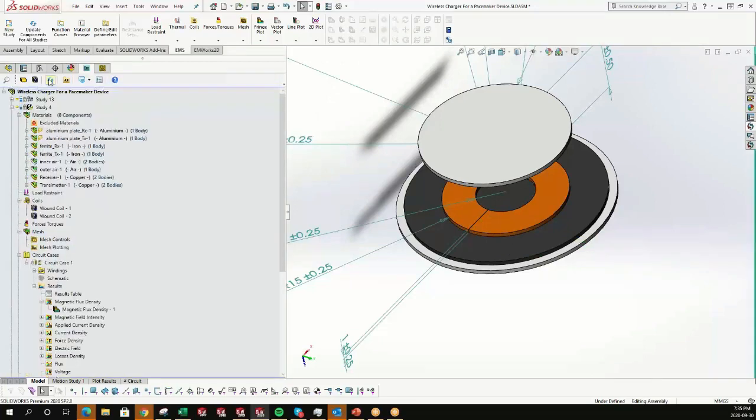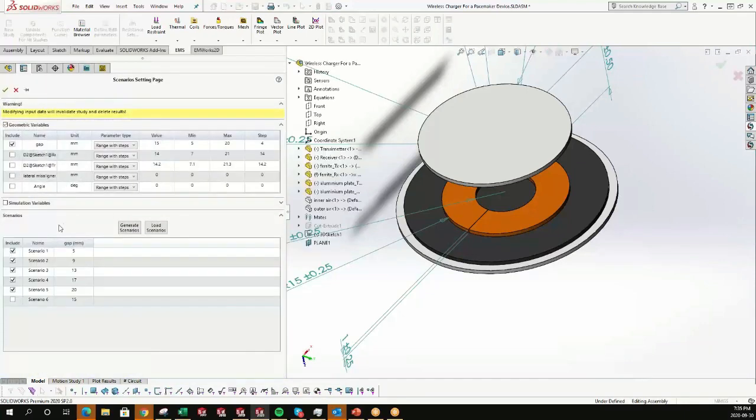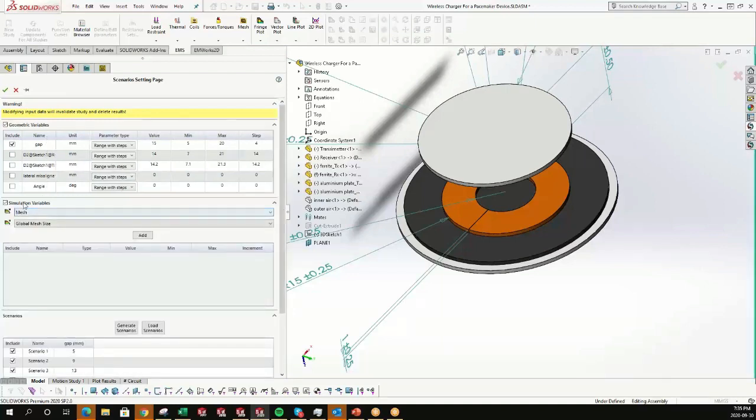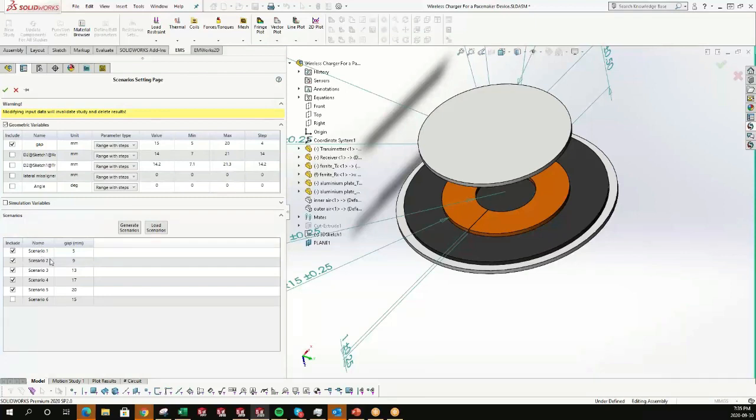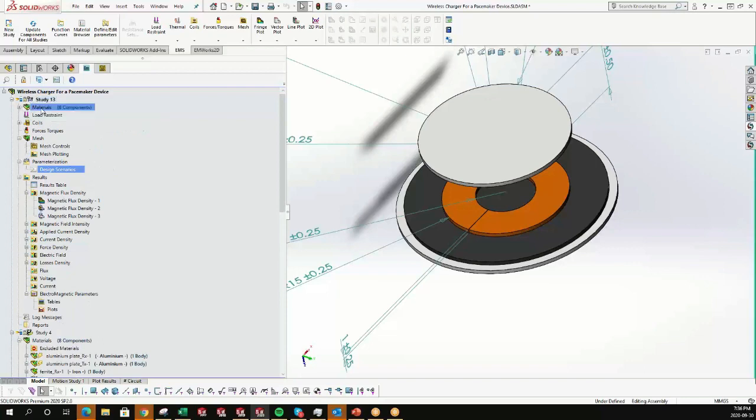So we have already created and solved 2 studies with parameterization. Let's take a look at the parameters. These are the design scenarios. We have some parameters, some variables, and we can add some simulation variables also. Here are the solved scenarios. We have different air gaps, and we run all these dimensions within the same study.